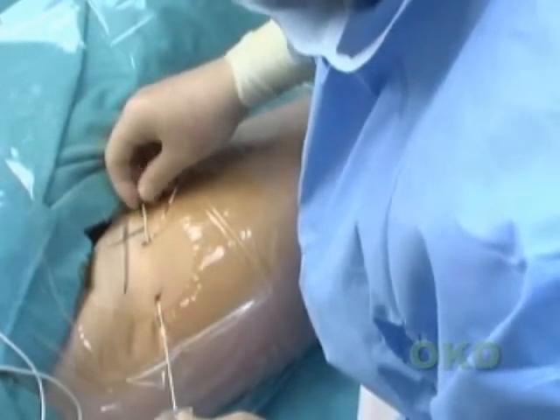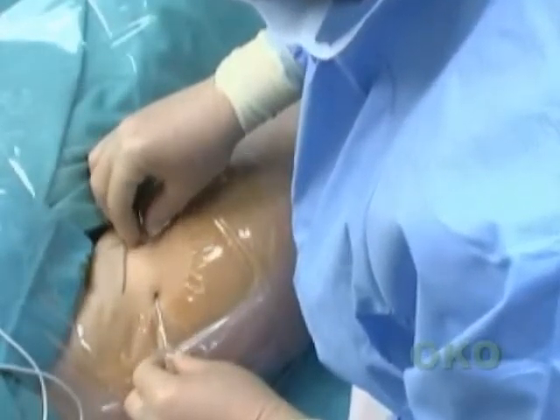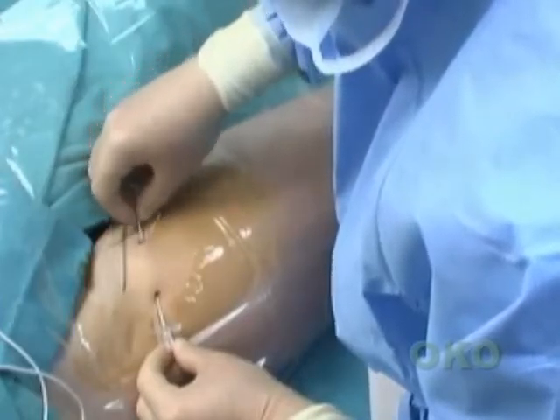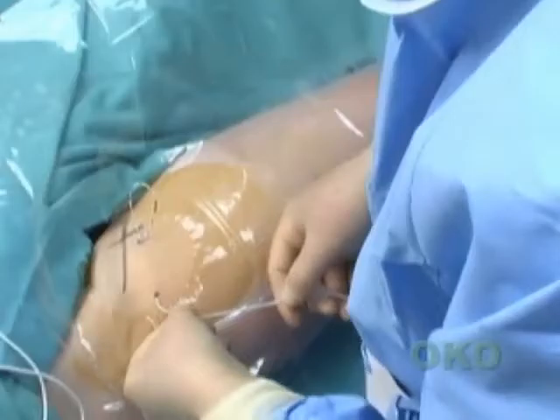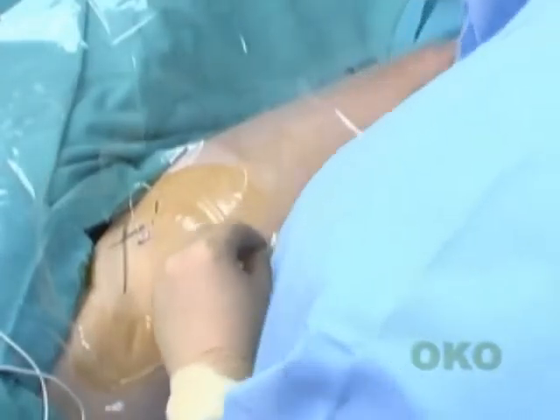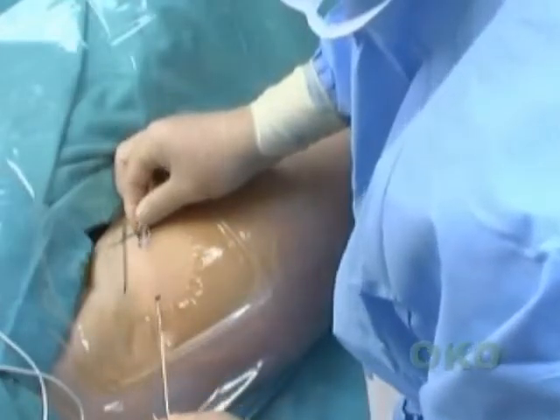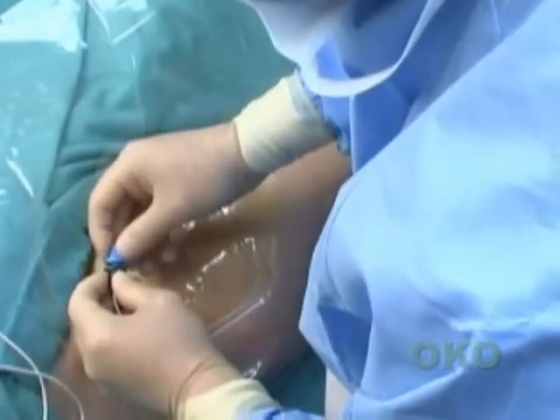The needle is railroaded retrogradely over the stylet, the stylet is removed, and the catheter is fed through the needle and the needle removed. The piece of silicone tubing that protected the catheter tip while packaged is handy to place in the loop made by the catheter to protect the skin under the skin bridge. The snap lock is attached to the proximal end of the catheter.